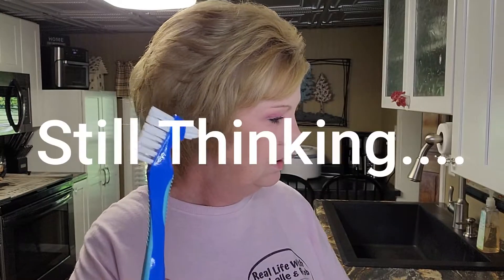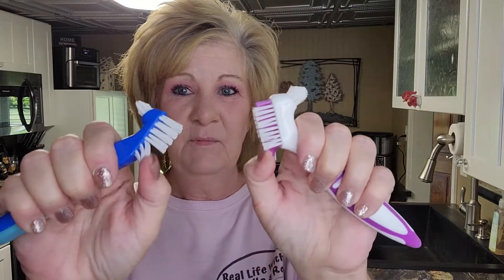This one is the GUM brand from Walmart — the website is gumbrand.com. You can see it's got a tiny little head, but it's a little stiffer. This is much stiffer than the one from Amazon. I got two of those for like seven dollars. I don't know if I'd want to use this; those bristles are really stiff.